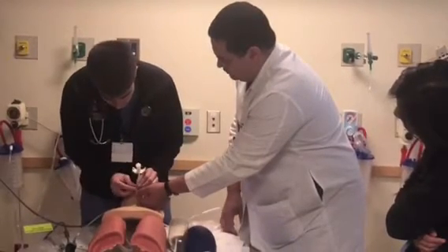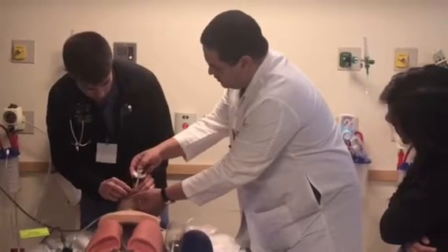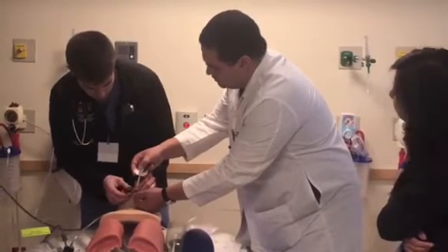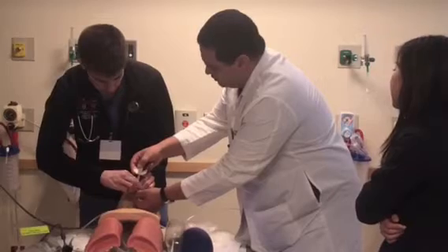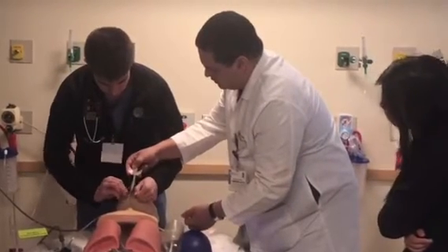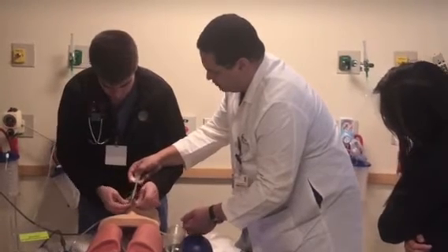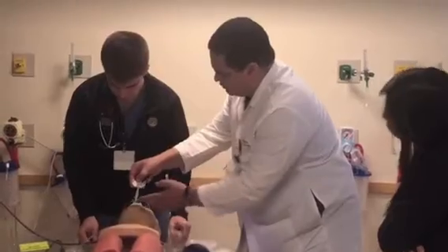Now what? Those things break from the side. Yeah, so break the needle. Pull the needle from both sides, this and this. Leave this, I'll hold the tube. So hold it. Break it. Pull, no, pull. Break it completely. Okay, that's it. So that'll be like this.